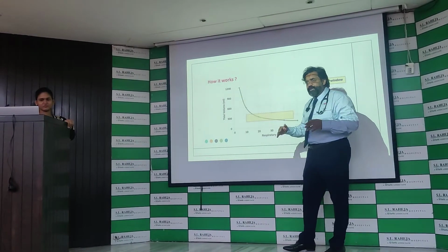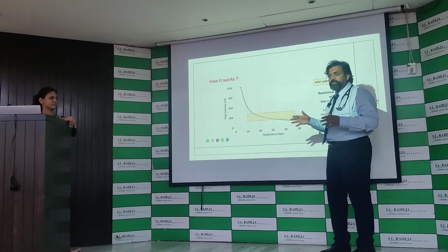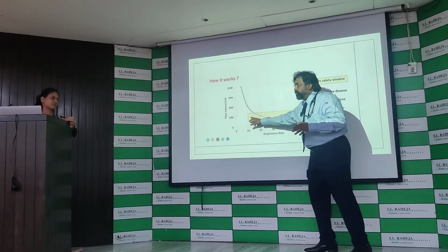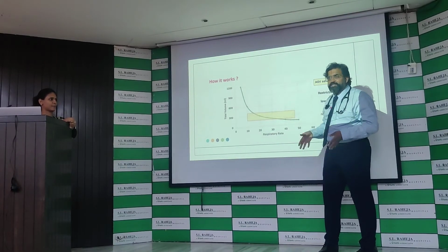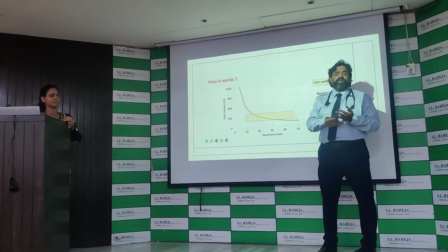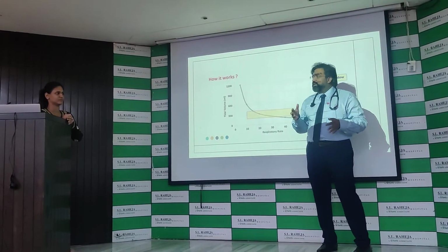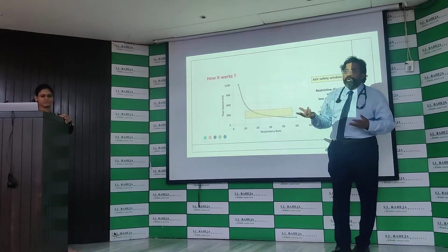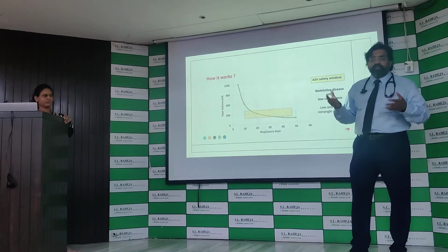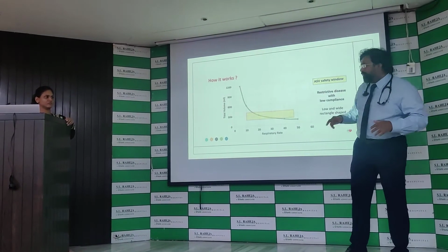Similarly, in a restrictive pattern, it is increasing the RR. So an ARDS patient will be in this window, and you don't decide that. The ventilator decides that, because the ventilator is calculating compliance. So it will see the compliance is 10. Once it sees the compliance is 10 on a regular basis, it will start figuring out that this is probably ARDS. This is probably not okay. It will figure out that this is ARDS, and it will quickly come to this.